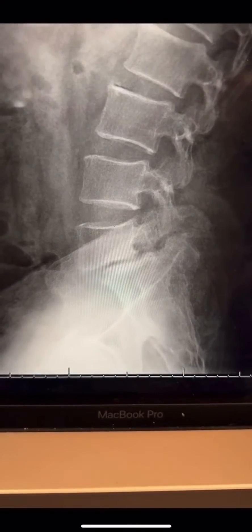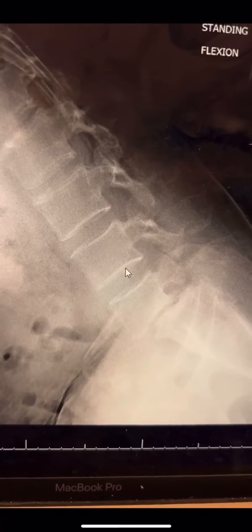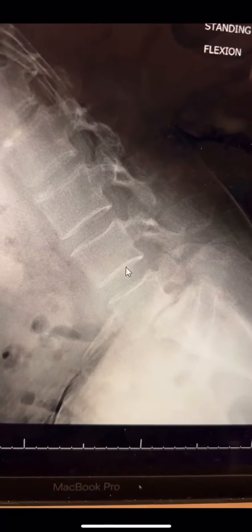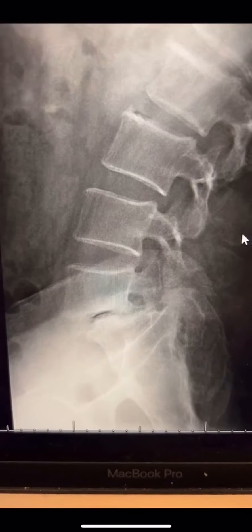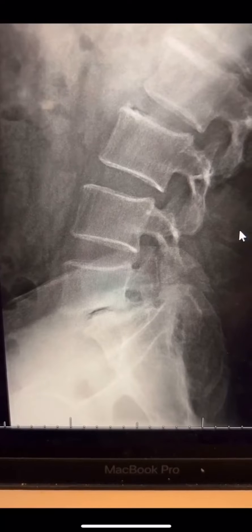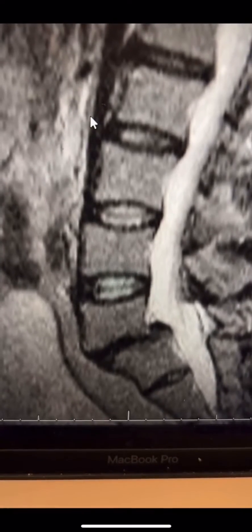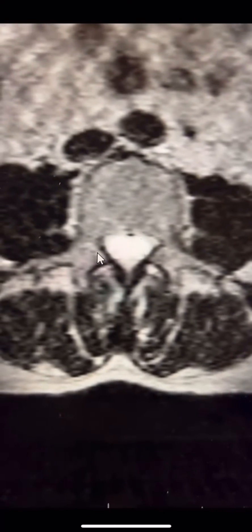Here is his x-ray. Here is a flexion x-ray — so this is with him leaning forward — and here is the extension x-ray, so basically leaning backwards and taking an x-ray. Here is the MRI scan of his low back, and here is the axial MRI.